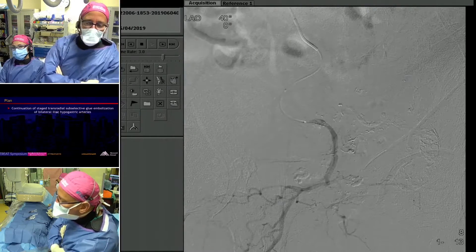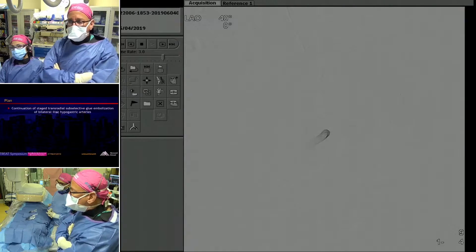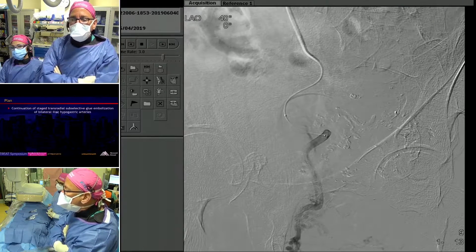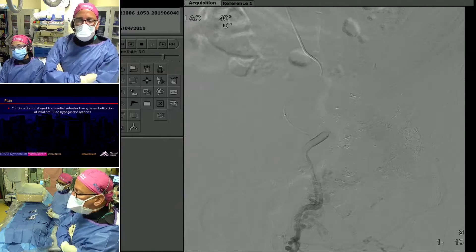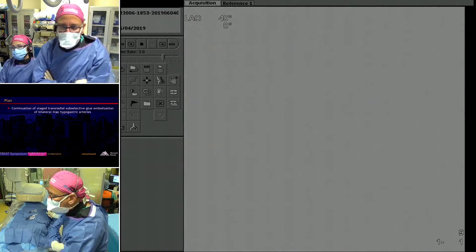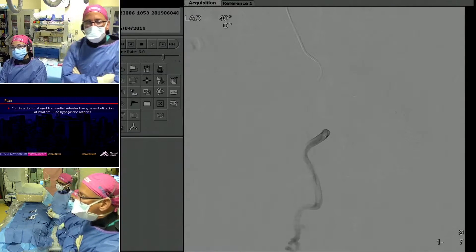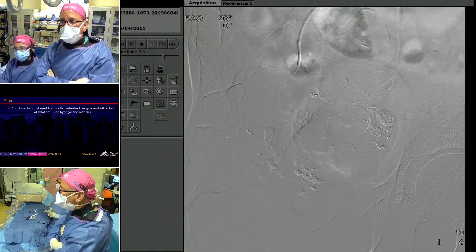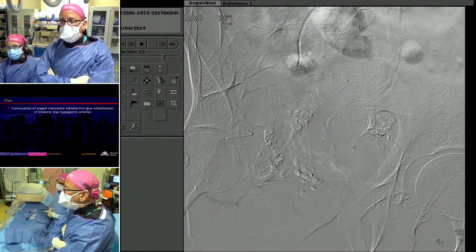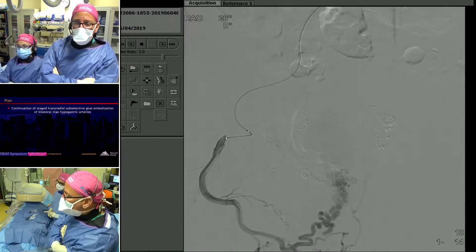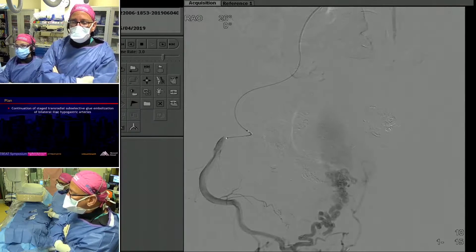Same normal anatomy on the next runs. Again the obturator, and again you're seeing just a lot of normal pelvic floor branches, which I thought was not worth the risk to try and sacrifice. That's just showing how that's a posterior branch — that's likely the obturator.